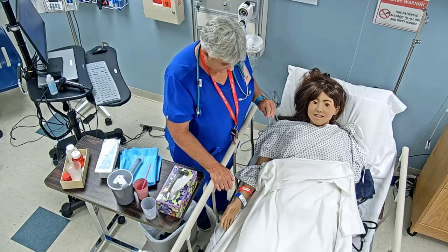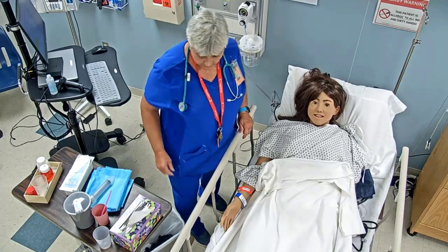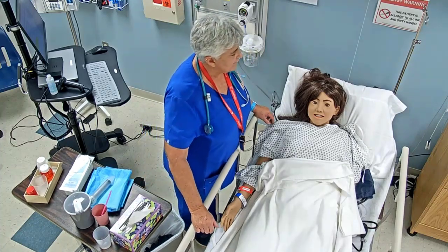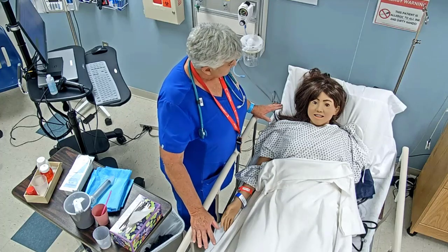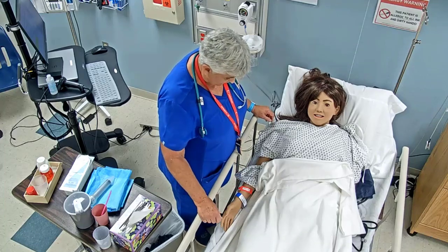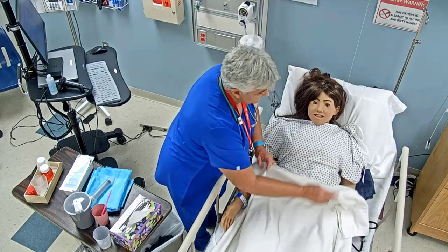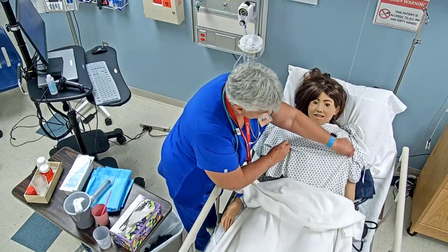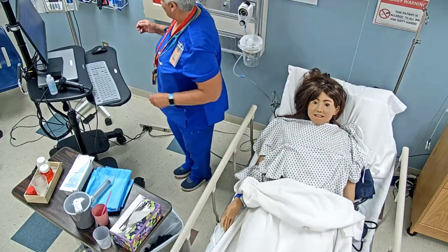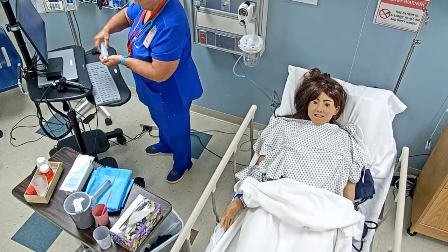No? Okay. And are you in any pain right now on a scale of 0 to 10, 0 being no pain, 10 being the most pain? What would you say? No pain? Okay, great. If you were, we would go through the pain assessment, but you're not in any kind of pain. At this point, I'm going to go ahead and wash my hands again, and I'm going to put some gloves on.